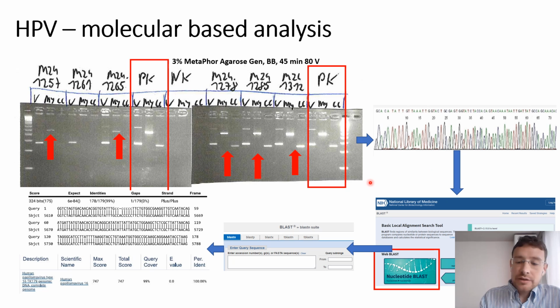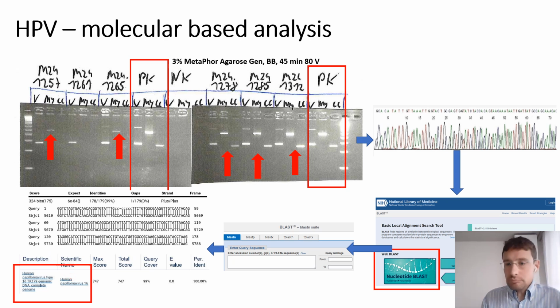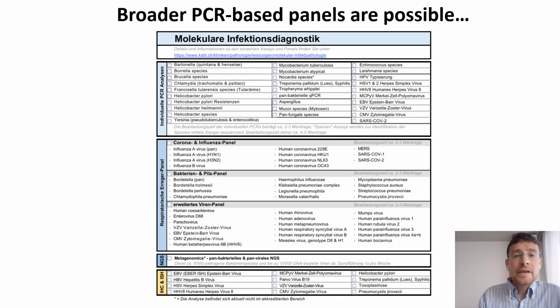So you may get the response here, and for example, in this specific case, we have human papillomavirus type 16. So this is quite reliable, quite sensitive. It's enough to have one positive cell per 7,500 cells, so quite a sensitive technique. Sometimes you do not know if you are dealing with a specific virus, so you may want to ask for a panel, and this is not done in every pathology lab.